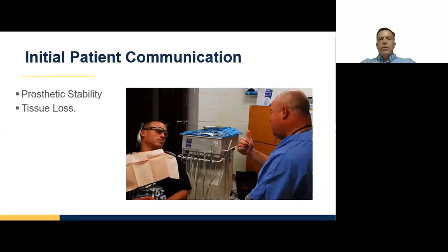When we're talking with our patients, we need to share a couple pieces of information with them to help their decision-making process and make sure that they're happy with the results they get at the end. A lot of times when you talk to patients who are currently wearing removable prosthetics, their greatest pain point, if you will, is the lack of stability of the prosthetic. Oftentimes they can get good aesthetics and reasonable phonetics, but the instability with chewing and speaking can be frustrating.